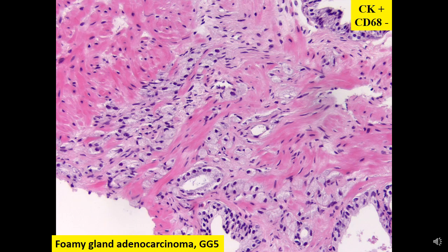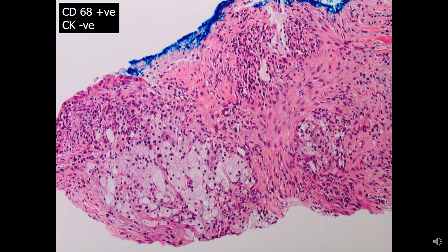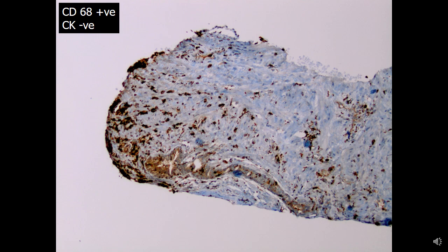Here is an example of poorly differentiated foamy gland adenocarcinoma — at the cellular level this is a great mimicker of xanthomatous infiltration. Helpful features are a rather infiltrative process, focal glandular differentiation, and perineural invasion. The nuclei appear hyperchromatic, and this process was cytokeratin positive and CD68 negative. Another example encountered in prostate biopsy shows haphazard proliferation, but a helpful feature is mixed inflammatory infiltrate — this was CD68 positive and CK negative, supporting the diagnosis of xanthomatous inflammation.